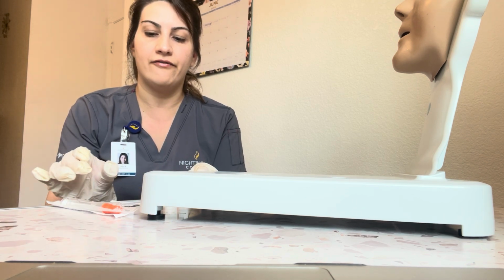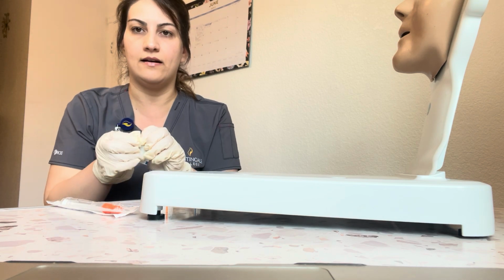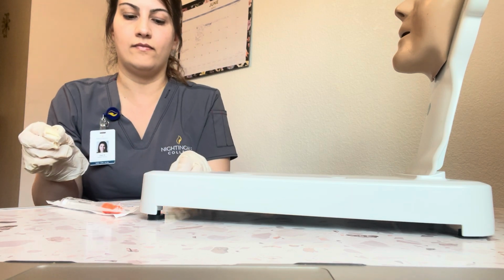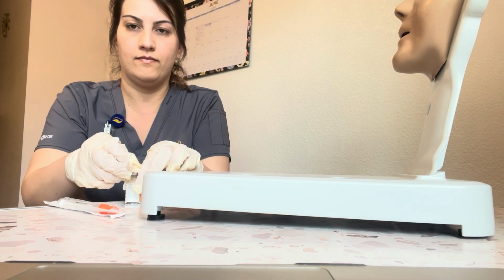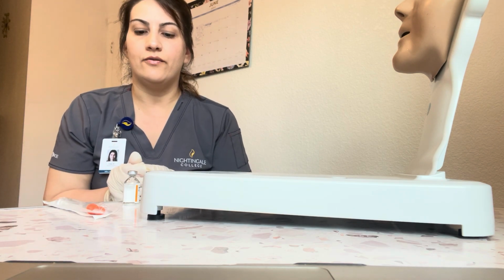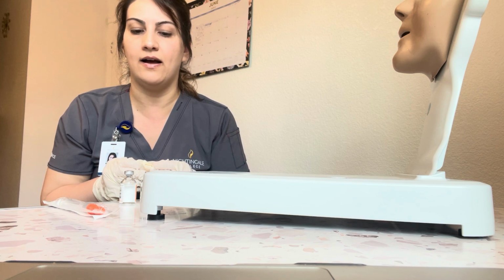I'm going to start off by rolling the medication vials. And I'm going to use my alcohol wipes and wipe the tops of them. Next, I'm going to draw up the 8 units of air, and I'm going to inject the air into the intermediate, and then I'm not going to draw up the solution.